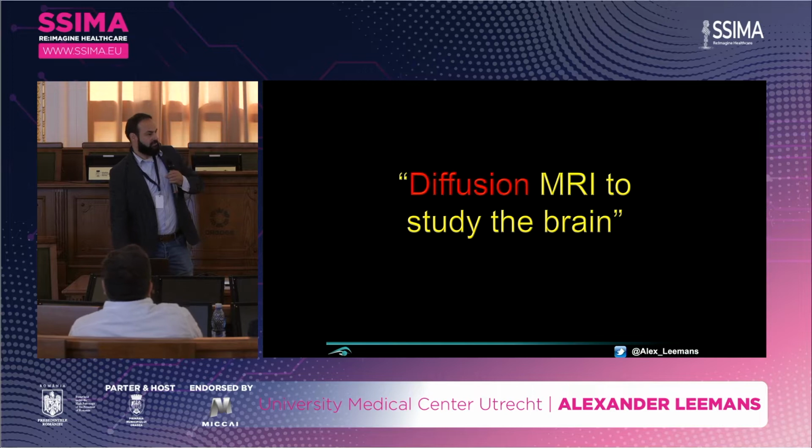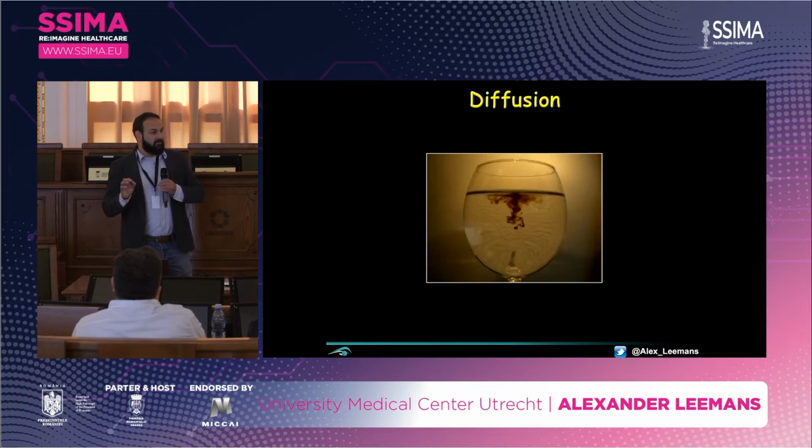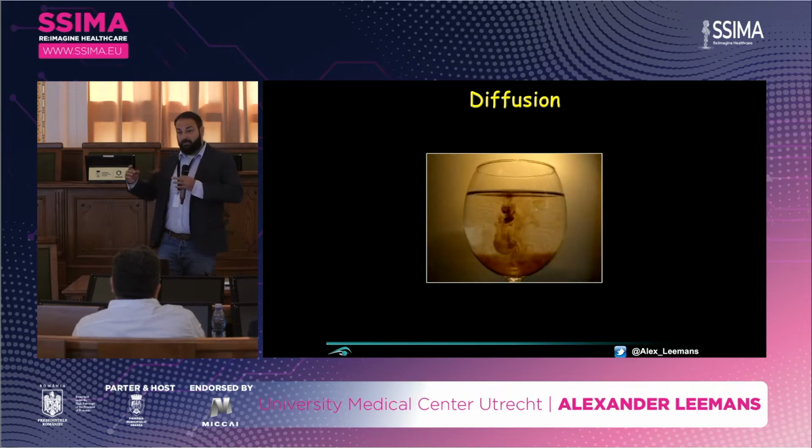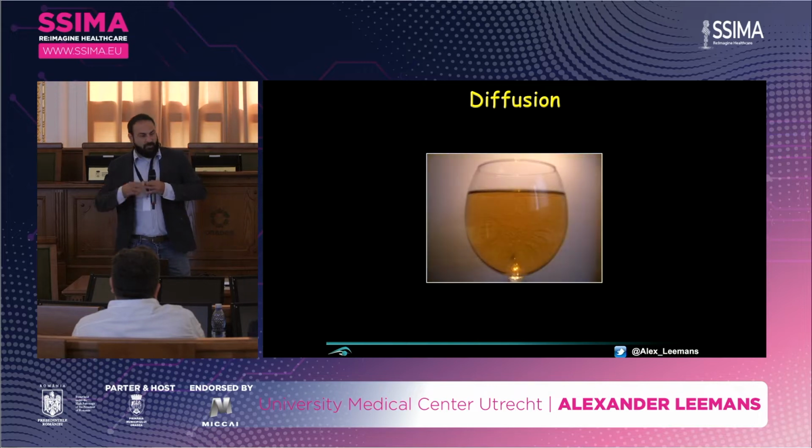What about diffusion? Okay, so diffusion. Well, think of diffusion as putting a drop of wine in a glass of water. And if we wait long enough, then all these wine molecules, they will spread out. They will diffuse in the glass. And you end up with this kind of homogeneous looking glass of water with this drop of wine.